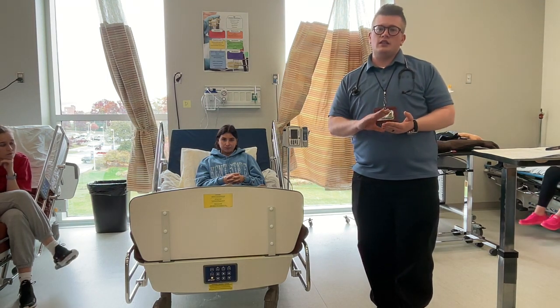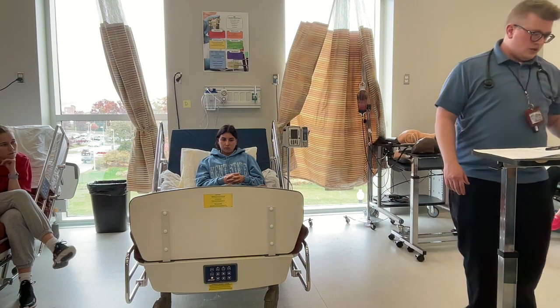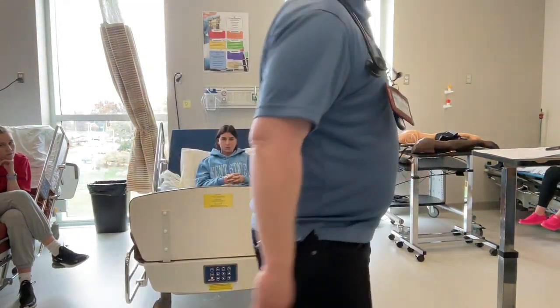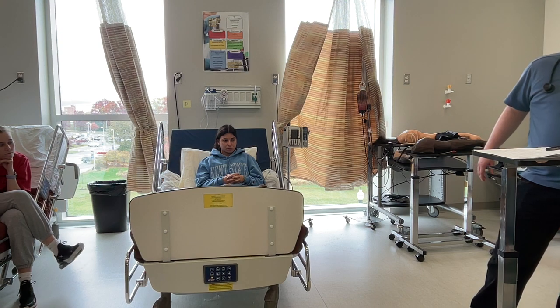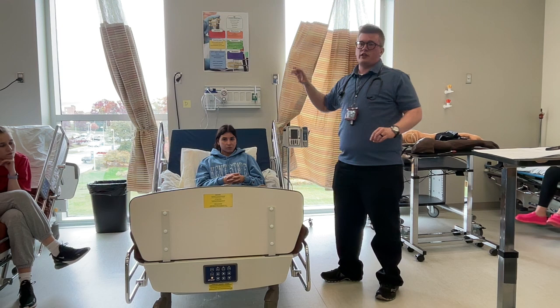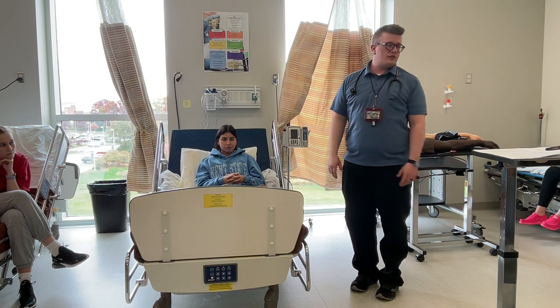Is it cloudy? Is it clear? What color is it? How much is it? When was the last time it was emptied? When was the last time that Foley was changed? Etc., etc. What size is the Foley? And then we're going to note that if she did have an IV, does it look infiltrated? Is it the correct fluid? Is it going at the correct rate? Etc. And also inspect that insertion site for any signs and symptoms of infection.